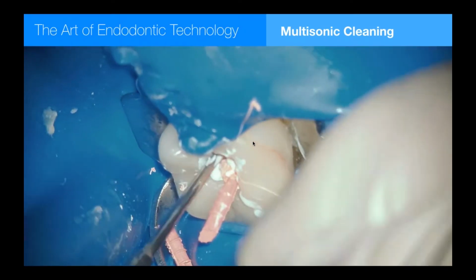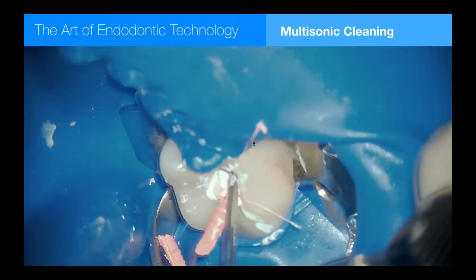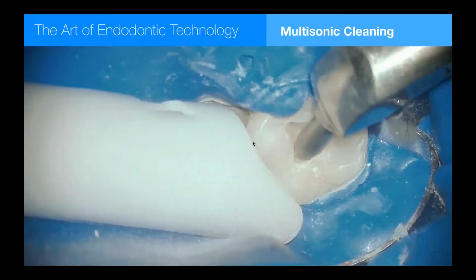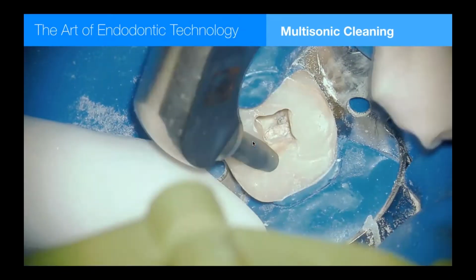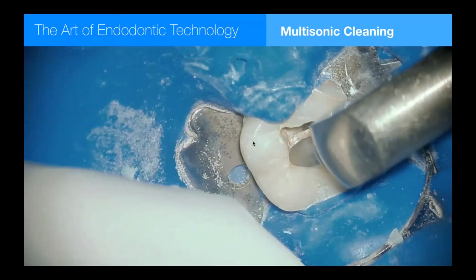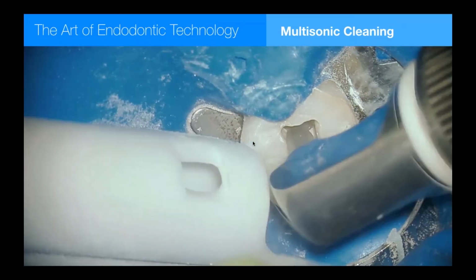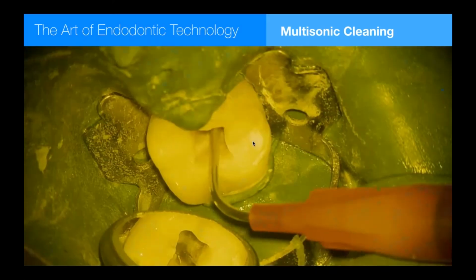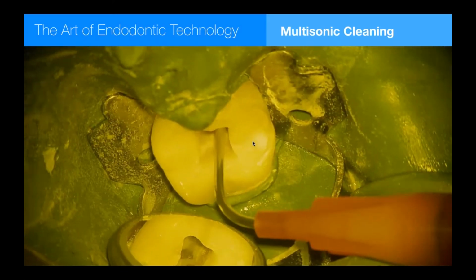So I'm using the edge of the plugger to cut the shank of the obturators, and check it out. Okay, so there are some days you look at post-op radiographs and you're just wondering how you can write the treatment report to explain how it looks. This one, you just go in your private office and dance like a little private hornpipe with nobody watching, and then go back and say calmly, you know, I think it's going to work out pretty well.